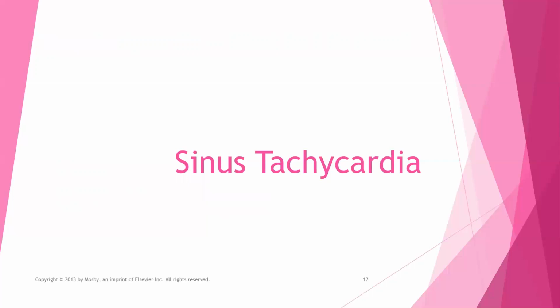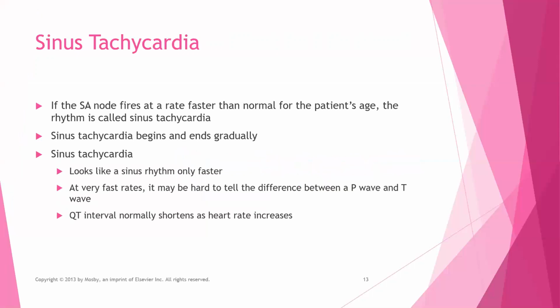Now let's talk quickly about sinus tachycardia, and I know you're going to know this. Remember, we talked already about this, that the normal heart rate varies with age, and in adults, the rate associated with sinus tachycardia is usually between just over 100, like 101, and 180.